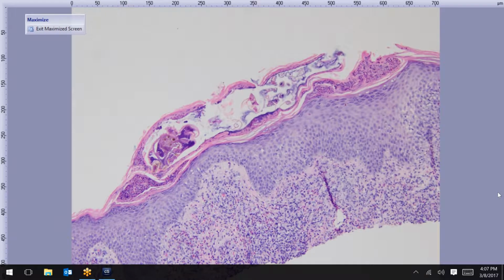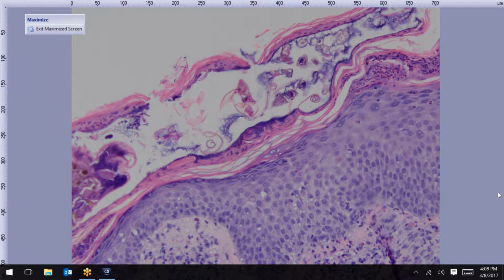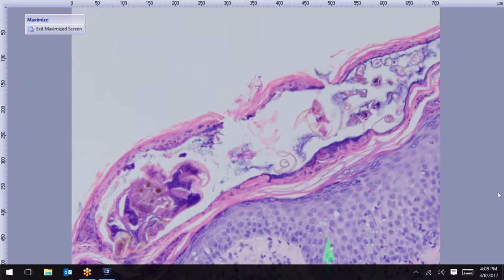Diagnosis, anyone? That's correct. Yeah, scabies. A couple people mentioned scabies. Nothing else does this, so there's nothing to confuse this with. When you see these little foreign sort of parasitic structures in the stratum corneum, that's pretty much what that is. And even for board examination, not too much effort is really needed to distinguish all the little parts of the scabies mite. You see something like this, you just know it's scabies, and you move on to your next board question.